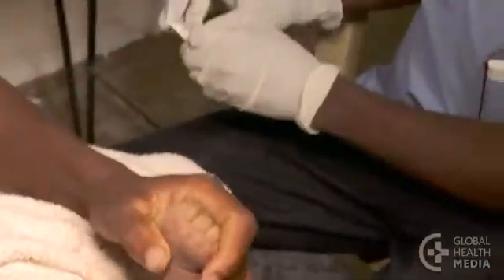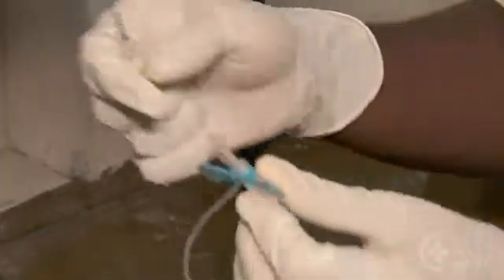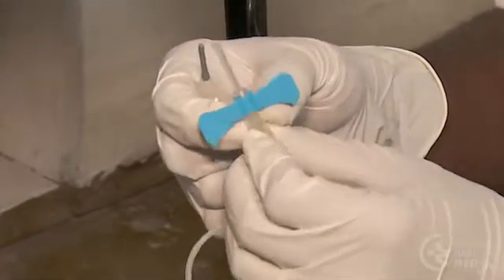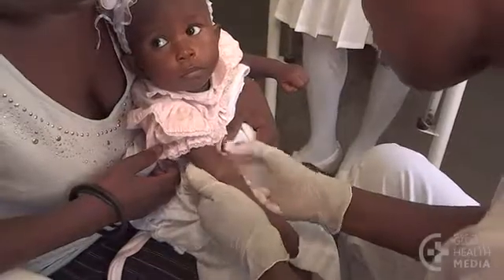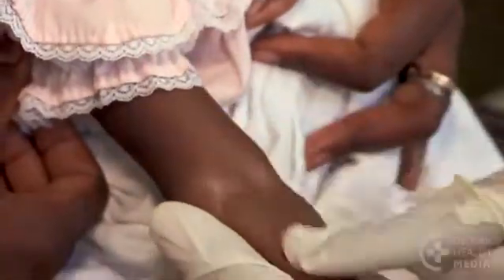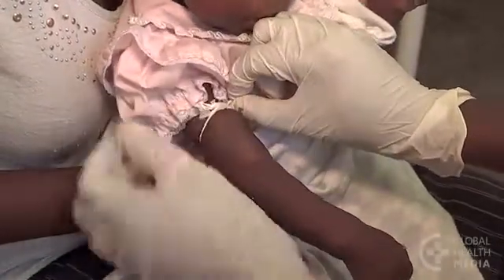The third way uses a sterile butterfly device. This is more costly, but like the needle, can be easy to maneuver. Find a good vein. Then tie the tourniquet so you can easily release it. Carefully clean the skin and let it dry.